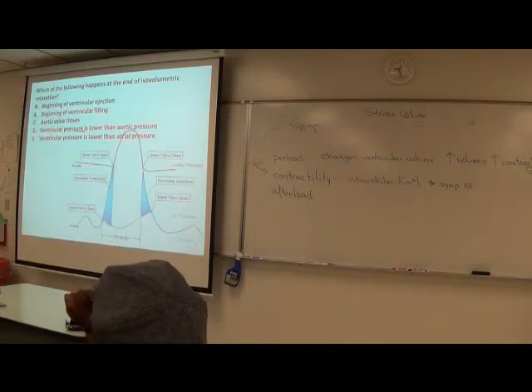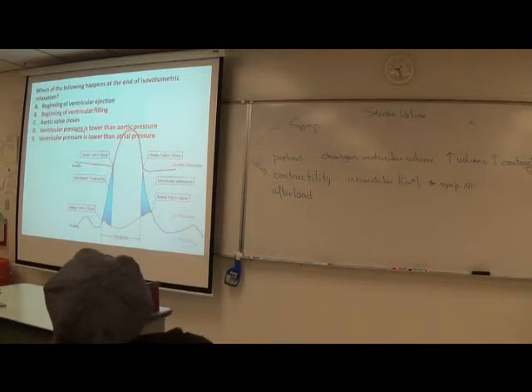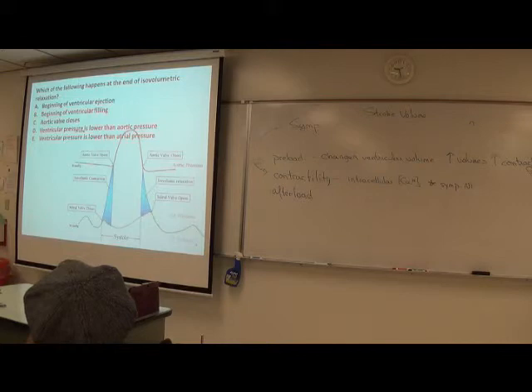A couple of things that we're going to be doing today. Starting on ECGs. So we have some quick and dirty ECG machines. By quick and dirty, they're not really dirty, but they're just a standard 3-lead, not a 12-lead. And they're not using the computer, so easy on, easy off.